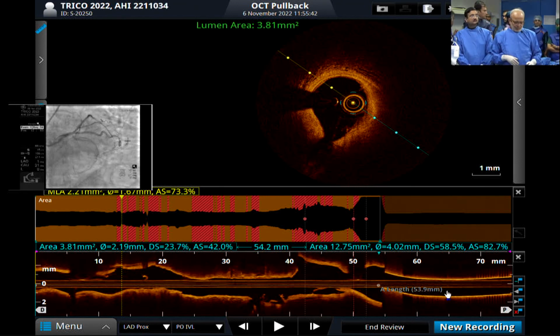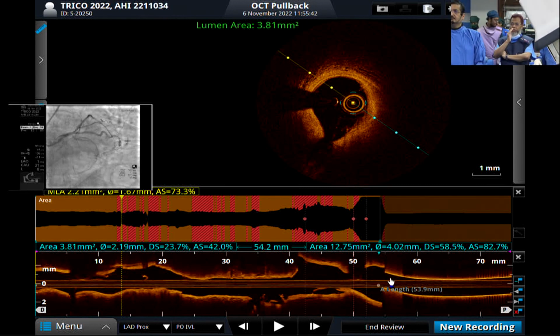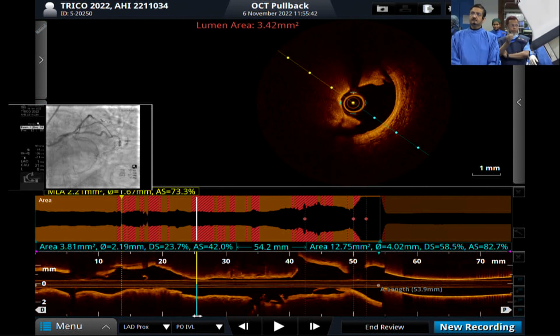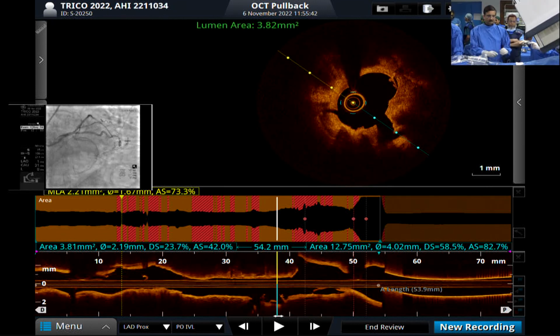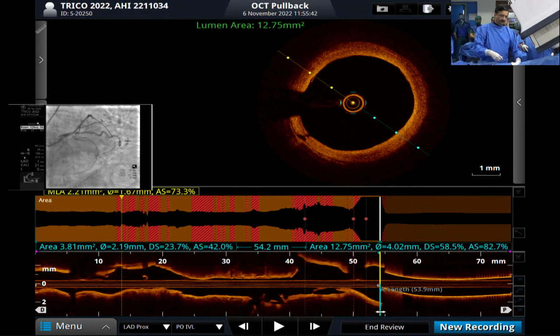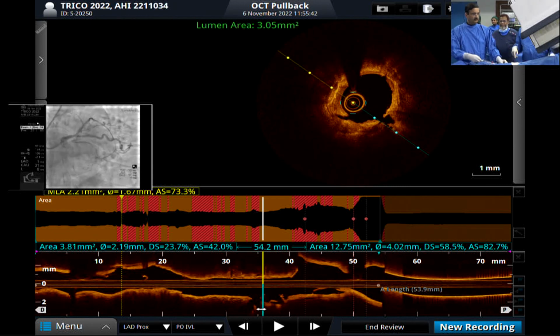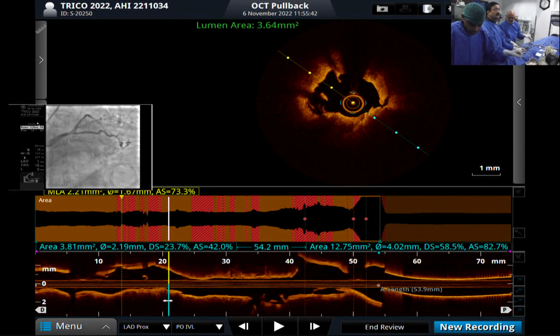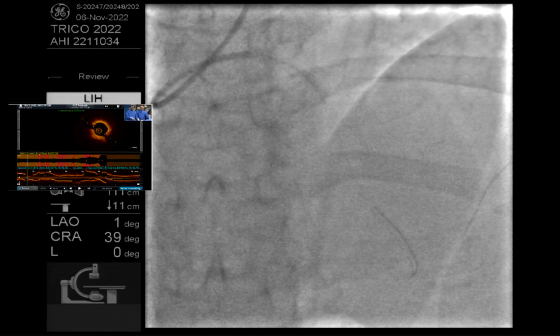For this type of lesion, sir, I have one question. There is a diagonal, so we should not overlap the stent over the diagonal. We should keep the distal stent. Then there is a problem, I tell you. Then there is a good chance that you dissect in the segment between the distal segment of the proximal stent and the proximal segment of the distal stent, because it's a small area and proximally I need a big stent. Let us see, if at all, I may go to epicardial, because what I keep in mind is how much revascularization I do, and how much I have compromised versus how much I have given. Yes.